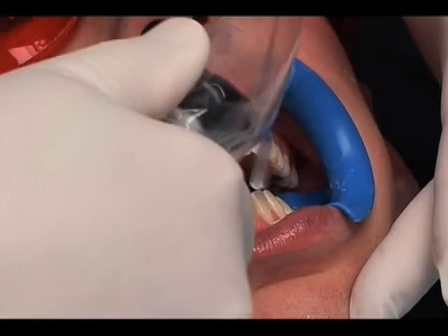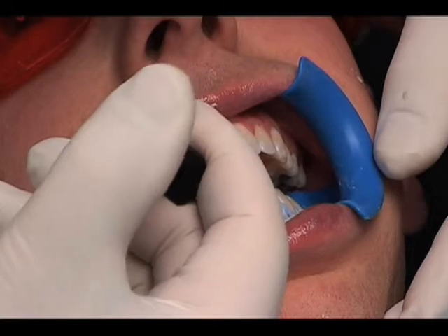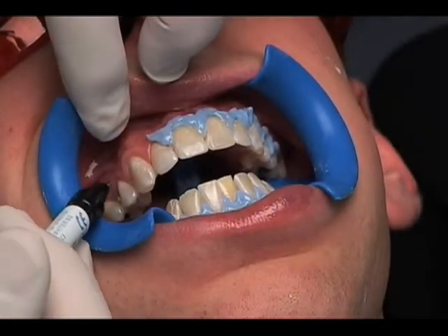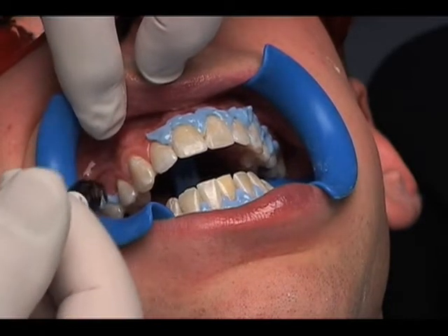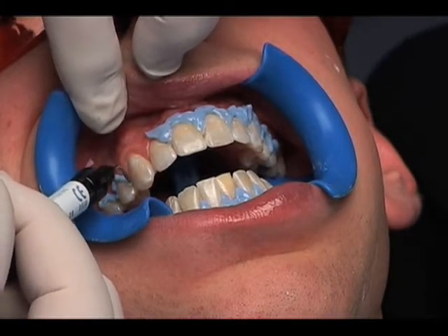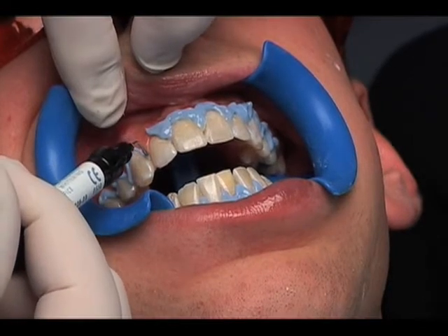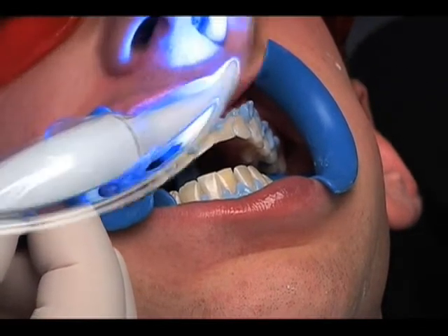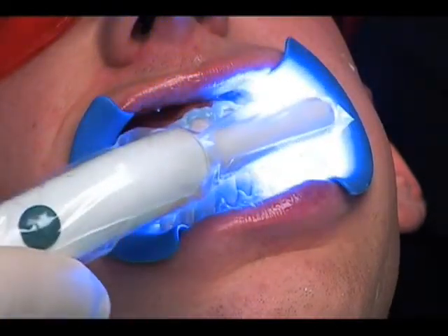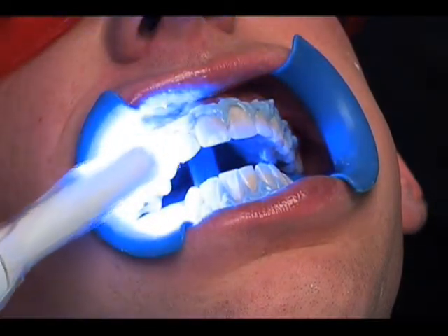Dry the teeth and gingiva using your air water syringe. Once dry, slowly apply gingival barrier to both arches. Overlap the enamel and interproximal spaces by about half a millimeter, paying extra attention to interproximal spaces. After this first application, apply another level of the gingival barrier until it extends about three millimeters on the gingiva. Light cure the gingival barrier in a fanning motion for about ten seconds until cured. Use an explorer or other instrument to be certain all areas are cured.